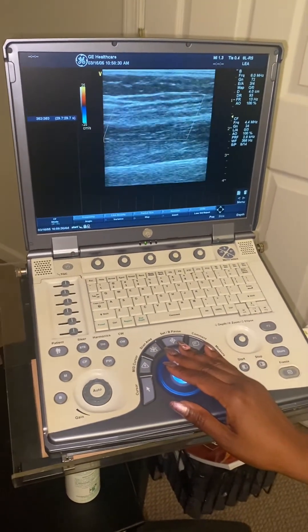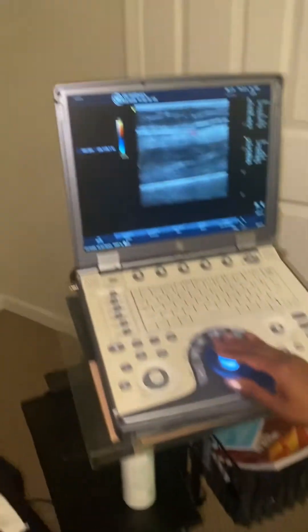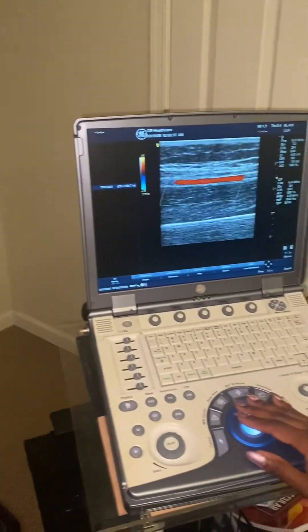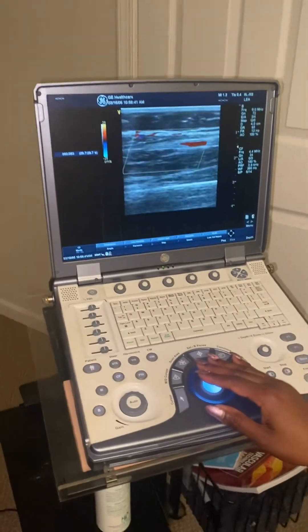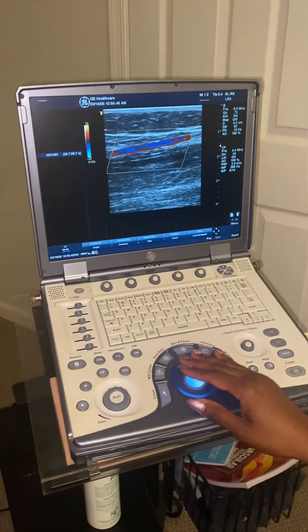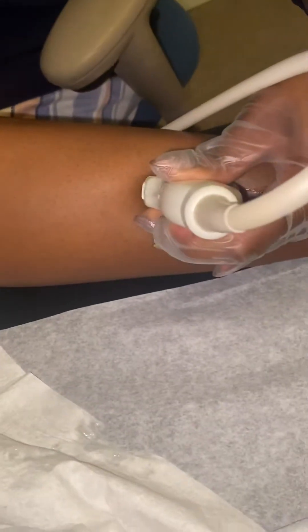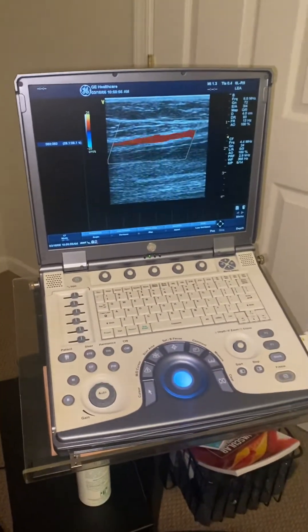I can follow it up towards her head, keeping it in view at the center, following up towards her head, keeping it in view. Right now I'm at the mid-calf, but you can always follow your posterior tibial right at that segment, just like that.